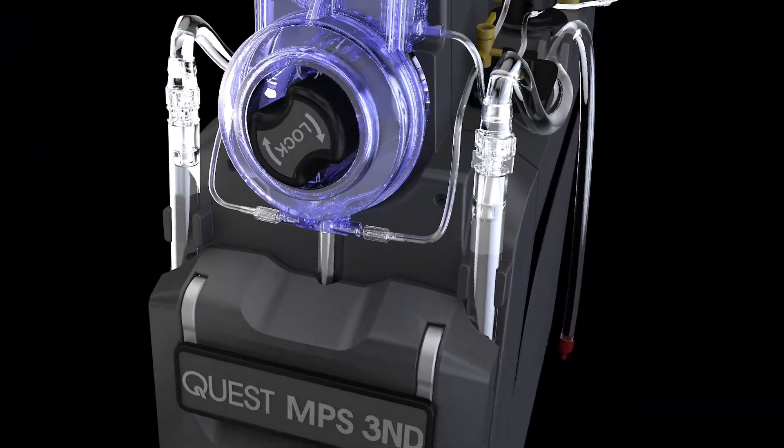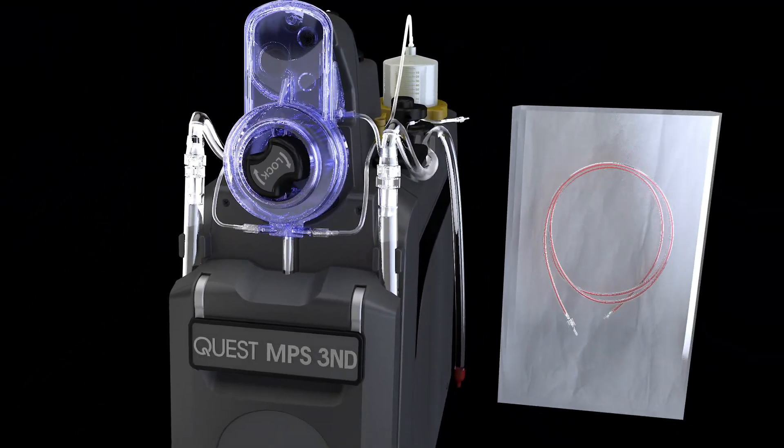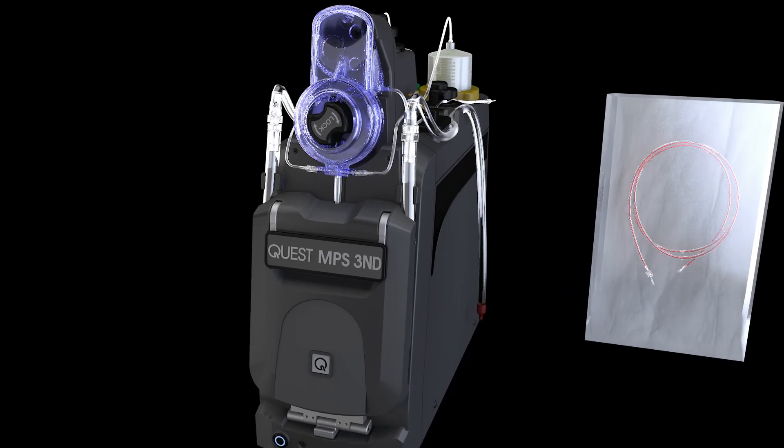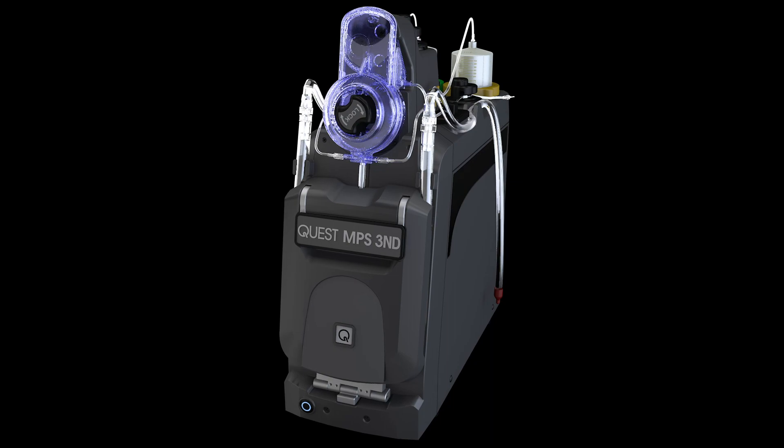Finally, hand the sterile package containing the sterile delivery line extension to the CV nurse. The CV nurse will open the delivery line to the sterile field.